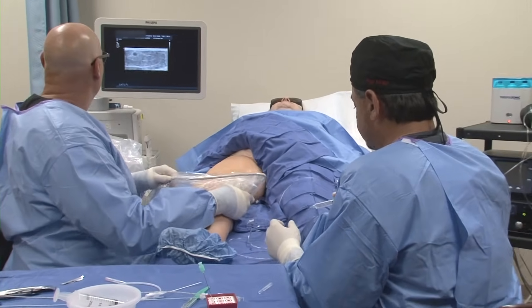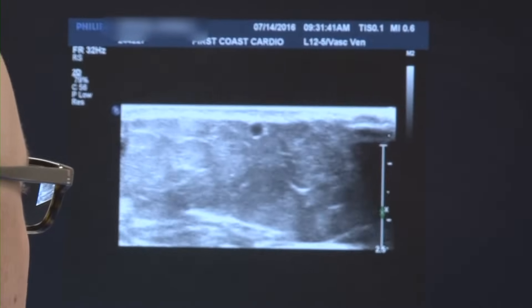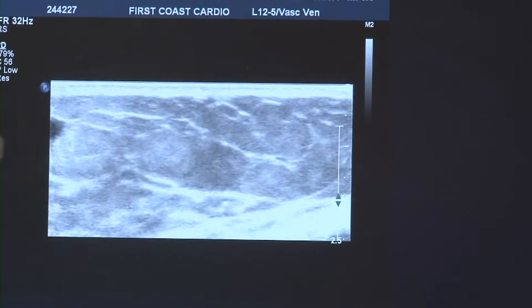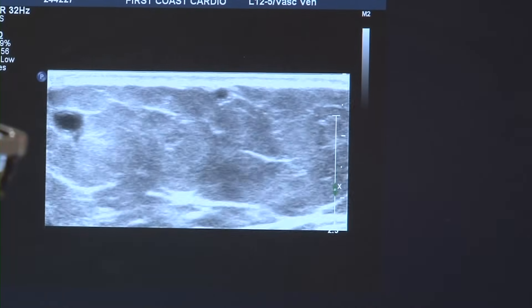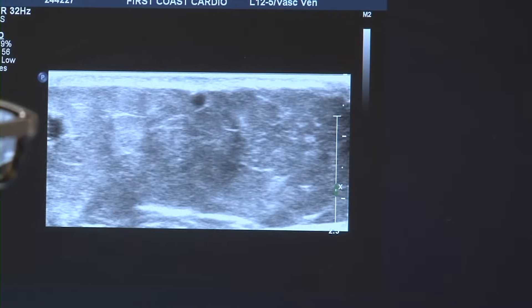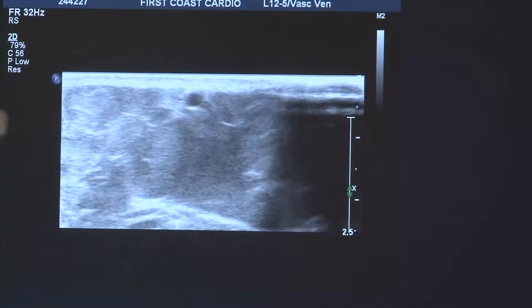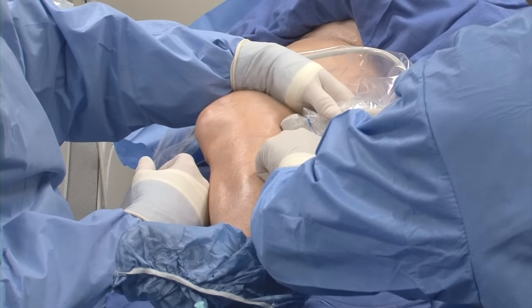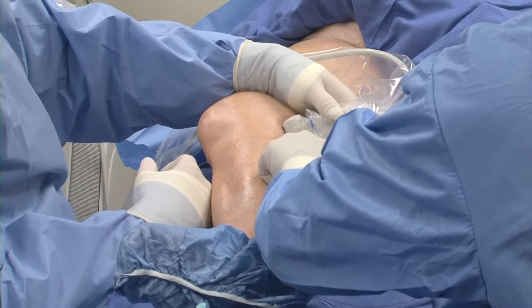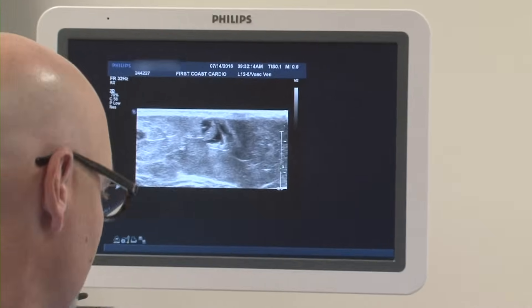We'll begin the procedure now. Here is just a hypodermic needle and I'm going to be numbing up the skin just above the vein. You can see at the very top of the screen — I'm going to compress it right here so you can see it kind of winking at you. This vein is a little bit more superficial, so it's going to take a little bit more technical ability to access. I press it with my finger to see exactly where I'm going to be accessing it, and you can see the depression on the screen. Now giving a little numbing — a little bit of pinch coming up. Here's my lidocaine. You don't want to give too much because then you lose where the vein actually is.